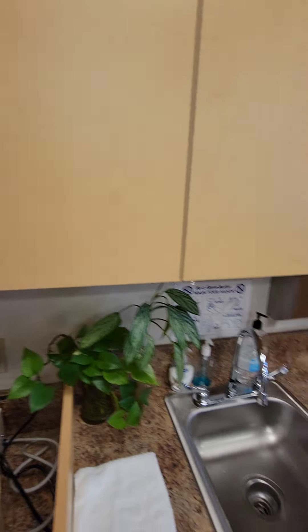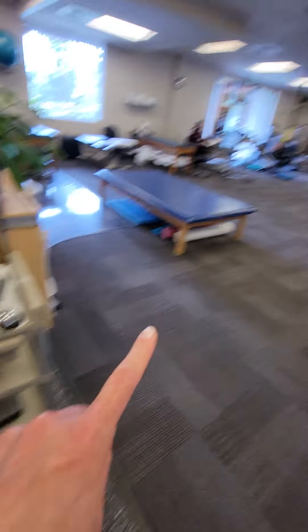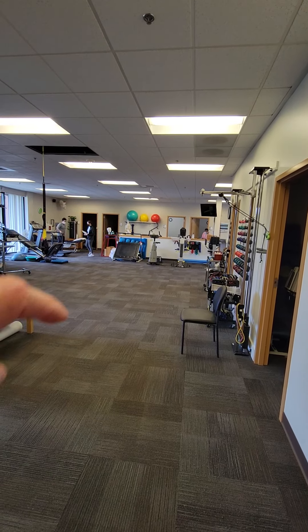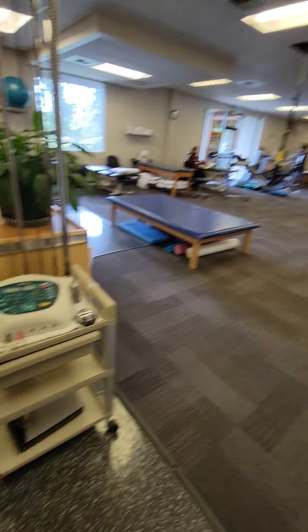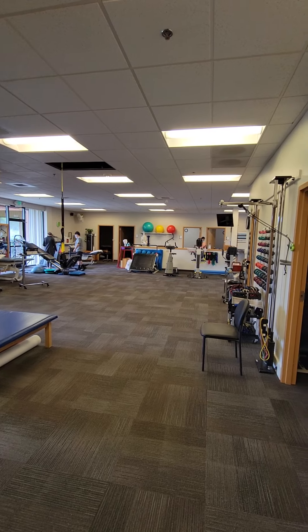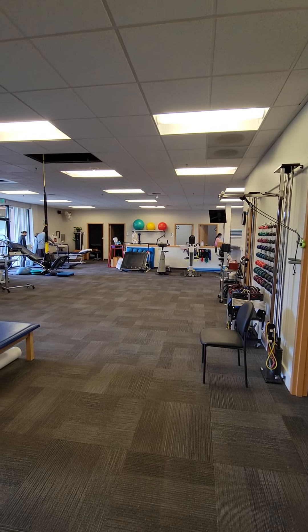Coming around here, there's the e-stim. If this machine's not here, across the way — on the other side of that island — is where you'll find the extra ultrasound and e-stim machine. The pads are in a container on top of that cabinet over there.